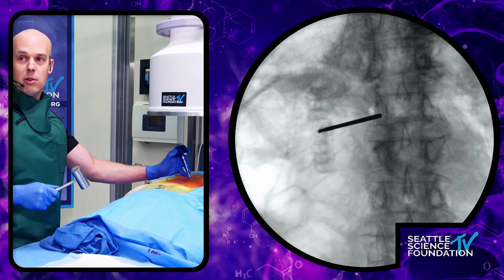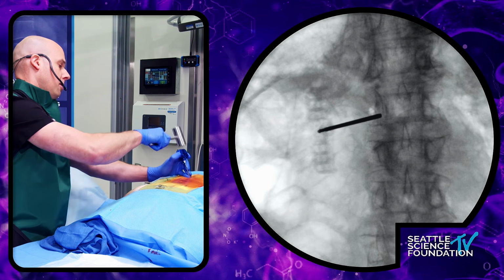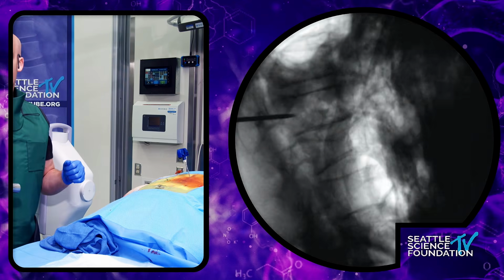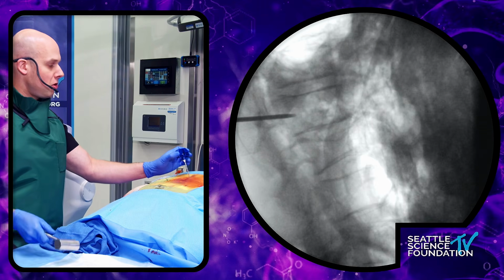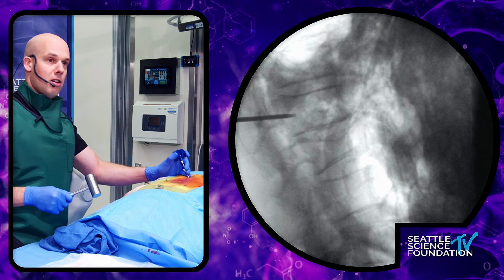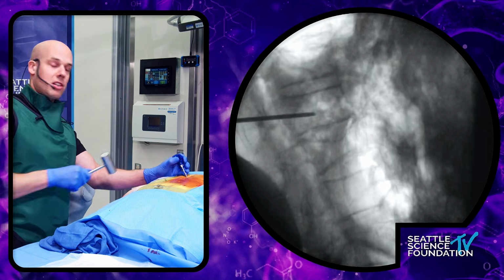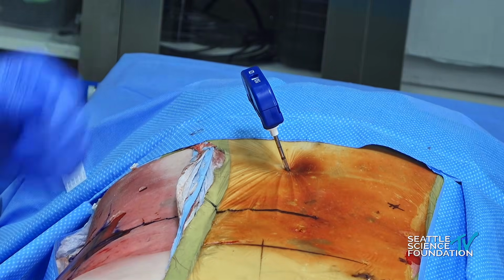We can go back lateral here, so we should be right in the center of the vertebral body. Perfect. So we pass the posterior wall. Now I will turn again 180 degrees, so the bevel goes more aggressively within the medial portion of the vertebral body. I'll also use a bit more pulling to be able to really medialize the tip. Perfect. And we're just exactly where we want.